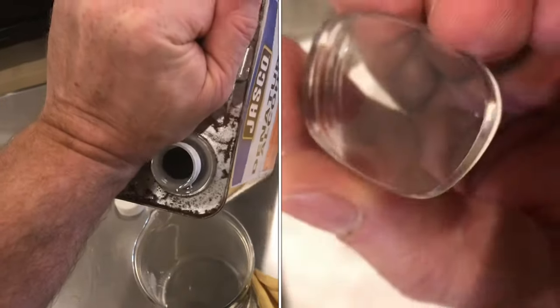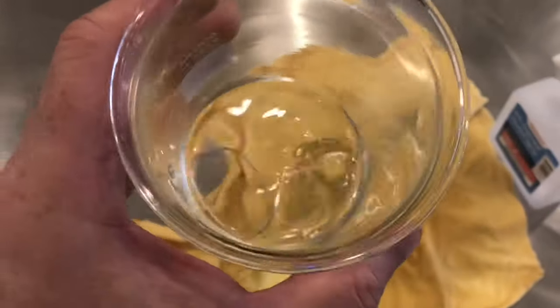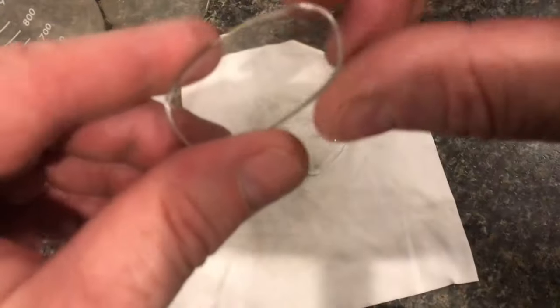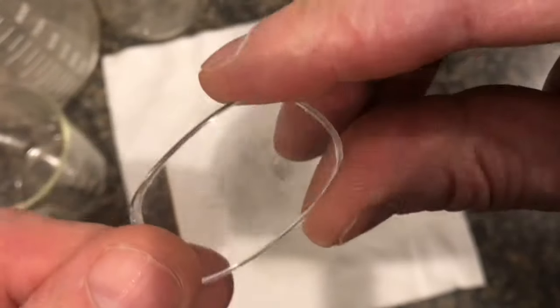I'll soak the second lens in this alcohol — drop it in, let it soak for about 10 minutes, and periodically pull it out and scratch with your fingernail. You can see with that simple process, all that coating is off and these lenses look pretty good.